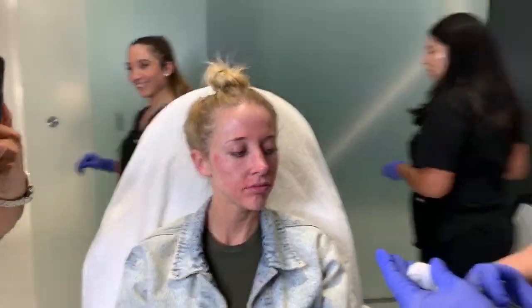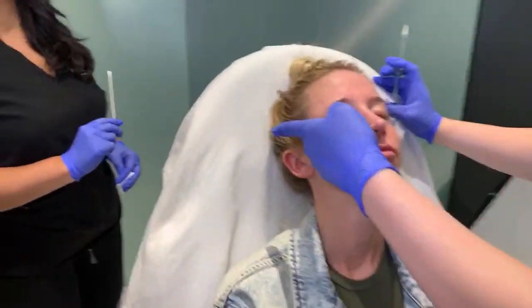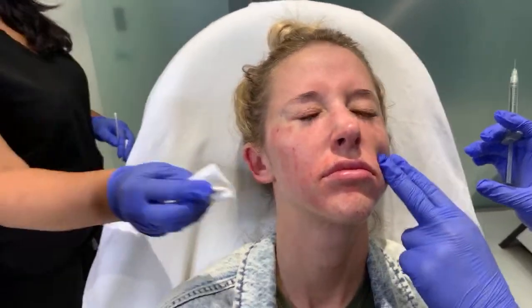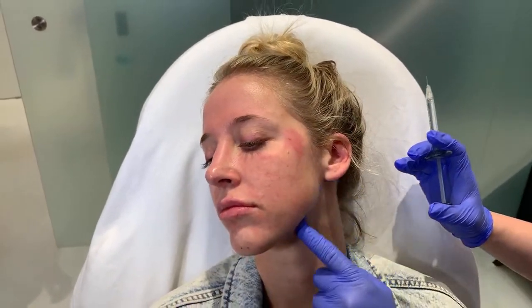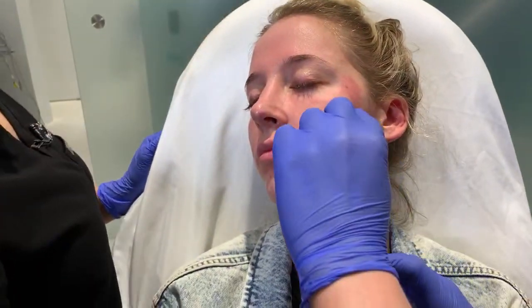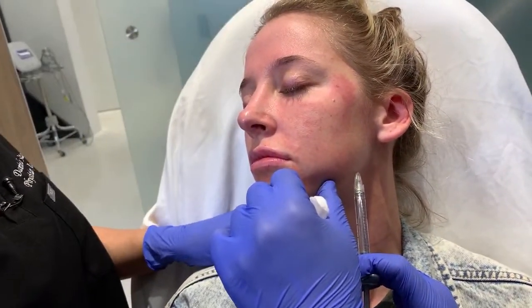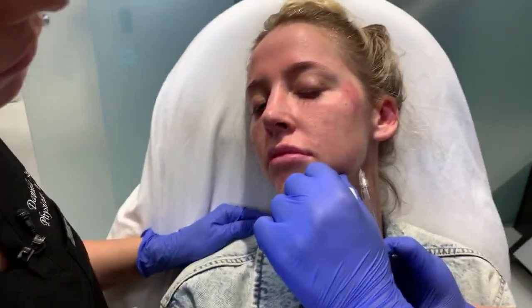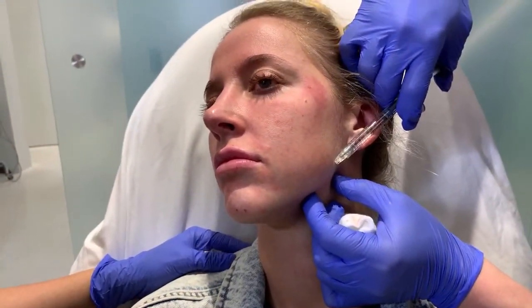Okay, last part. This is gonna be the cherry on top because we did a nice blending. If you take a look, lay back just a teeny bit, I wanna show people. We have a nice angle here, but with the type of face she has, the mid-face is a little bit more flat. So to make it where everything doesn't feel sort of downturned, if you turn to the side, we give a little definition on the jawline. So what we're gonna do, not a lot of filler, very little. She doesn't need much. We're just gonna come back on the edge of the jaw and do some very fine, subtle threads, just to give her more of an angle to her face.